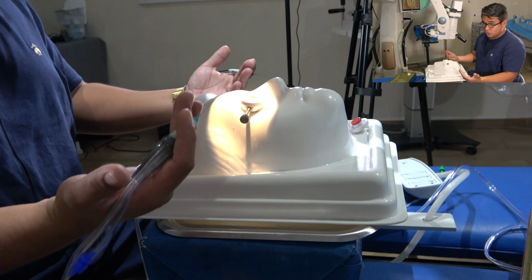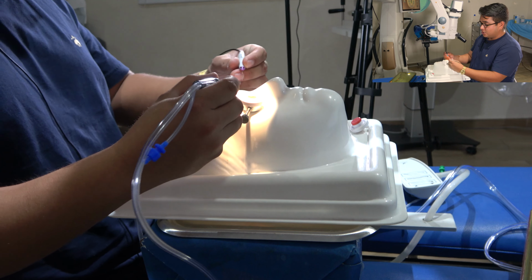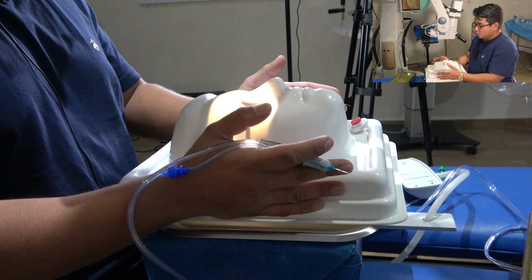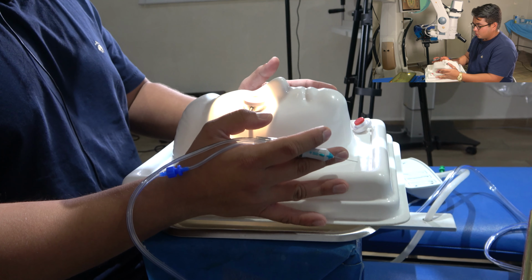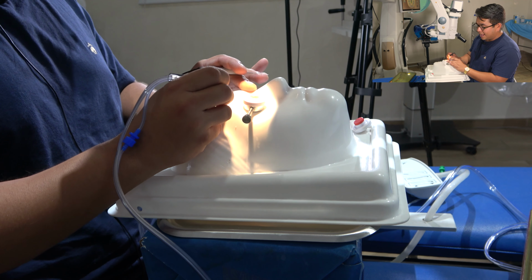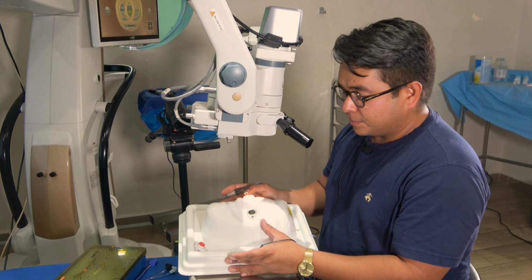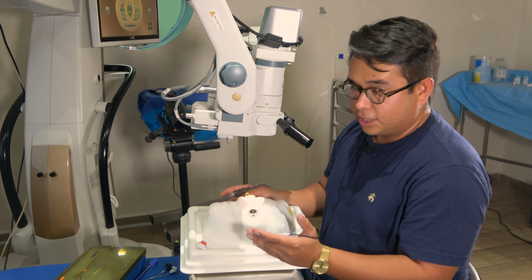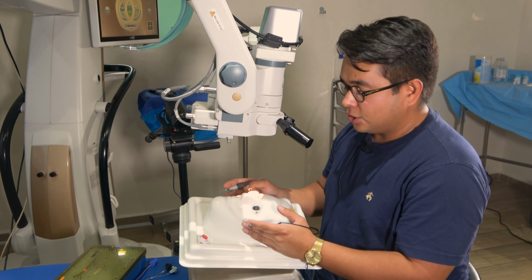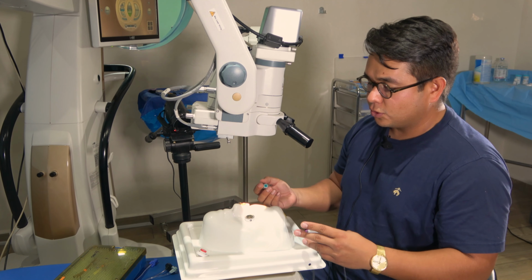You can also use the position of the neck to your favor. If the patient has a superior lesion, you can hyperextend a little bit, or if the lesion is in the superior nasal quadrant, you can put your patient a little bit to the left side of the contralateral line, so you can achieve a better visualization and a good treatment of those lesions.